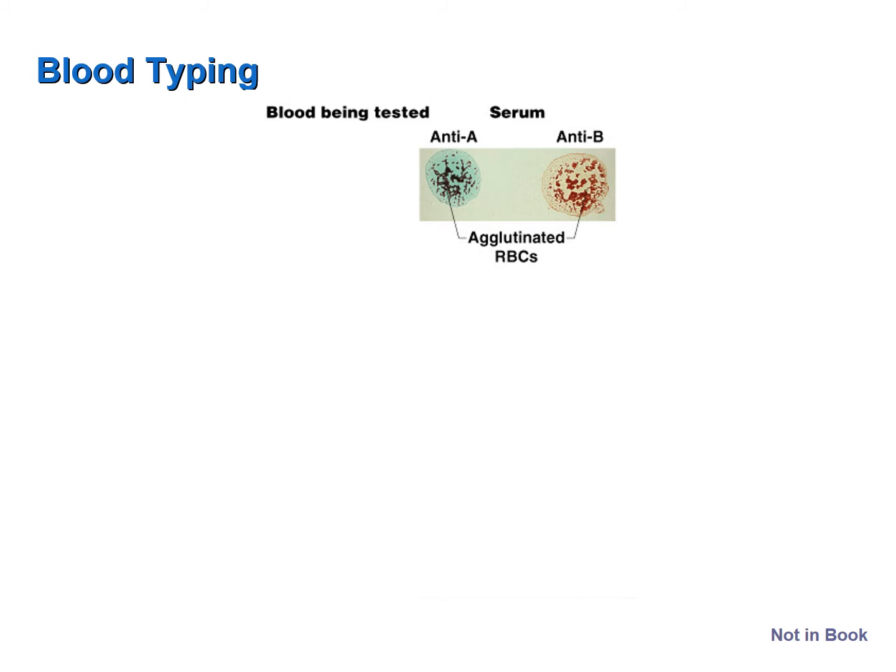That means that the antibodies found their antigens. The anti-A antibodies found A antigen, and the anti-B antibodies found B antigen. Therefore, this first individual has what type of blood? If you said AB, you are correct, because both antigens are present as revealed by the agglutination that occurred when we mixed anti-A antibodies and anti-B antibodies with samples from this individual.